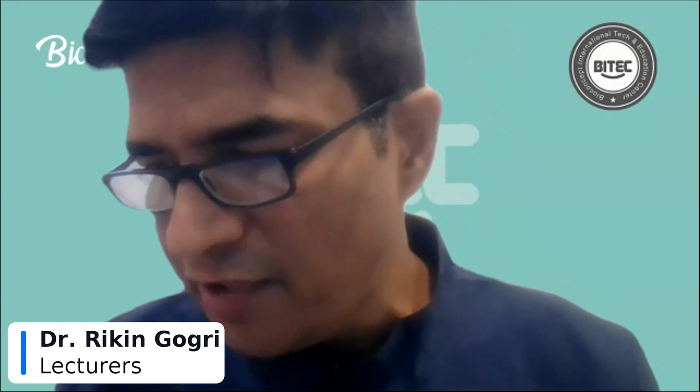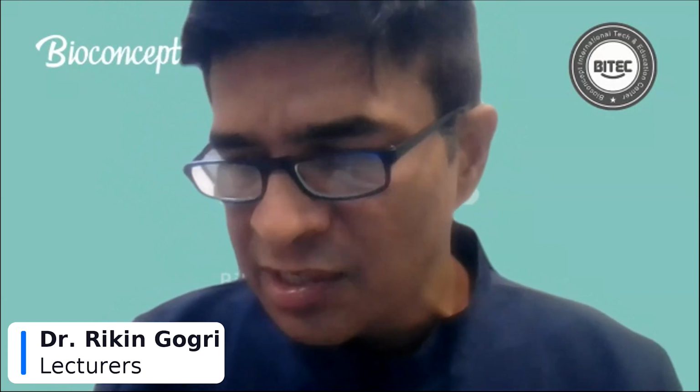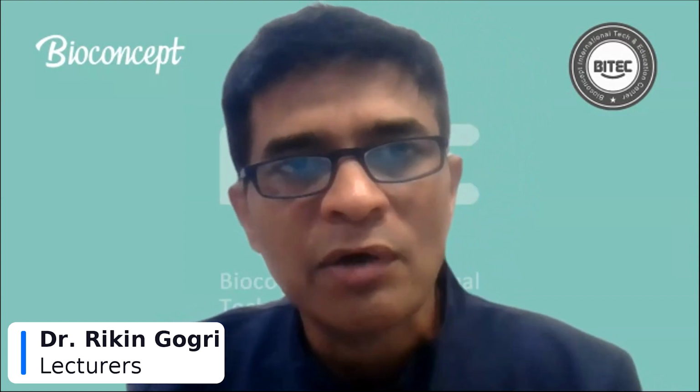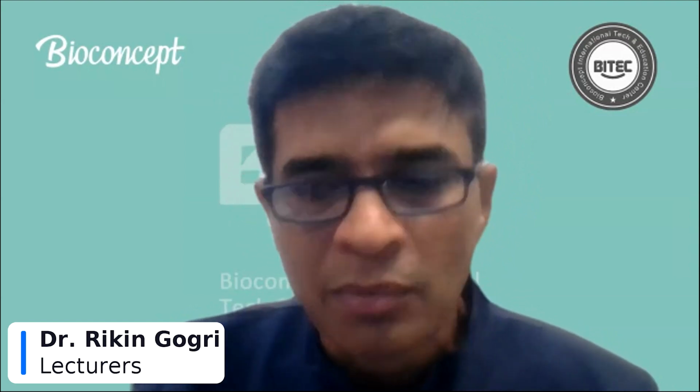Regarding how to choose the implant size, we have already clarified, I guess. Then the second question is, after raising a flap, how to guarantee the aesthetic effect of the gingiva. The ideal flap design should always be a little palatal or lingual to ensure that you have enough soft tissue on the labial or buccal surface. This is more important during the second stage when you are going to place the healing abutment, because that will ensure that you have enough soft tissue bulk labially or buccally for your prosthesis to give a good emergence profile.